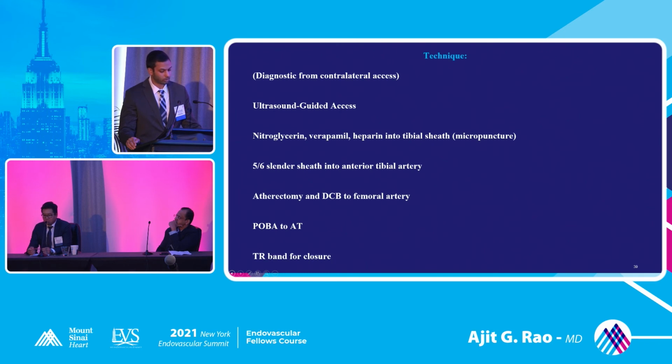I try to go higher up because I think it's easier to salvage if you stick around above the ankle, because there you could potentially balloon and you could use a larger balloon. And generally the vessel is a little bit healthier there. I shy away from sticking the dorsalis pedis or the PT in the foot unless I absolutely have to, because I think those are higher risk for failure.